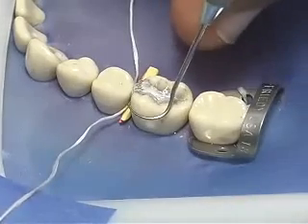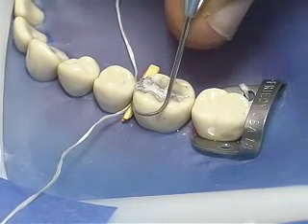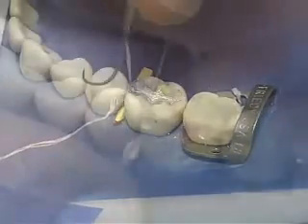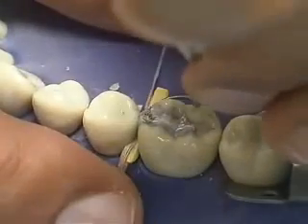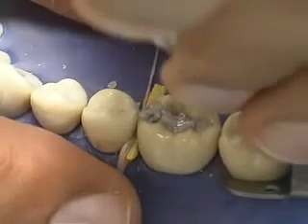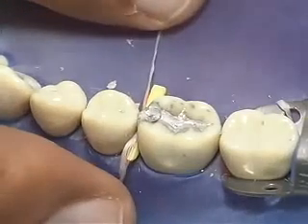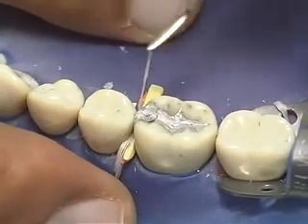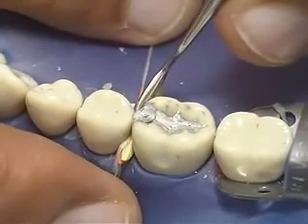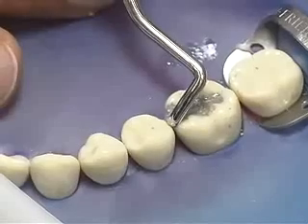Place the tip of the explorer against the adjacent tooth, with the blade resting on the existing tooth structure of the tooth's proximal surface. Use a shaving motion from cervical to occlusal to shape the proximal surface and remove any excess amalgam. Use one of these instruments to also remove any excess amalgam from the cervical region to define the gingival cavo-surface margin. Proximal carving should define both the occlusal and gingival embrasures.